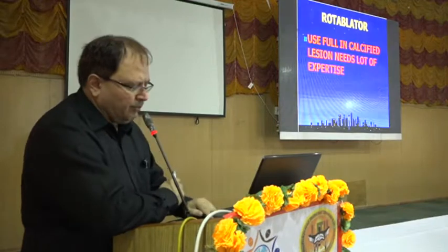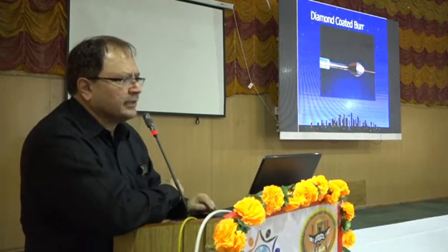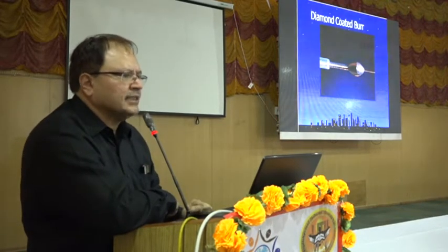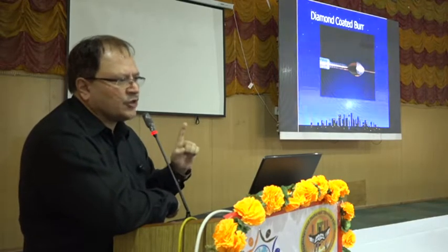In this, we put a rotabur. Basically, the rotabur is a diamond piece. So this will rotate at the speed of 1,60,000 rotations per minute.